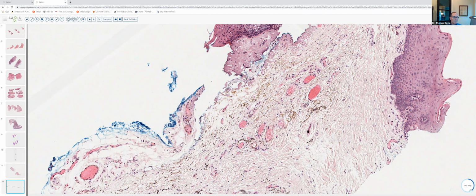I think it bears some similarity in the size of granules and the color to what you see in Argyria, but rather than being deposited in the basement membrane, it's going to be present on fibers in the dermis. So this is kind of a fun session, but it's kind of high yield and good to recognize these materials and structures. And I'm sure most of you know in the back of Elston in an appendix, he's got a whole little section there on external agents. And he also covers cautery artifact, I would take a look at that.